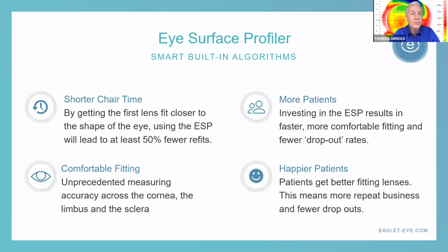So it's a lot more comfortable for the patients, and more comfort means they're going to stick with it. Scleral lenses, after all, in particular, there's a lot of work with sclerals. You have to insert them a certain way. You have to use certain things. You have to use solutions. So the easier we can make this for patients, the less burdensome, the more comfortable, it really creates a wow factor and enhances your practice and the satisfaction of your patients.